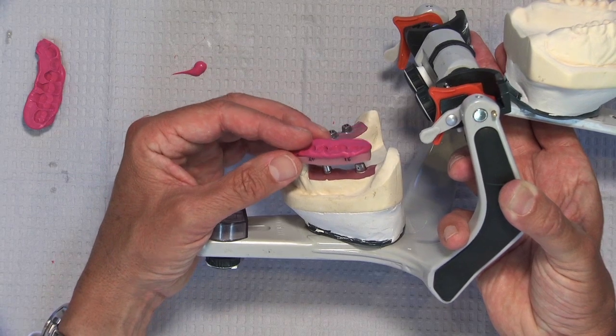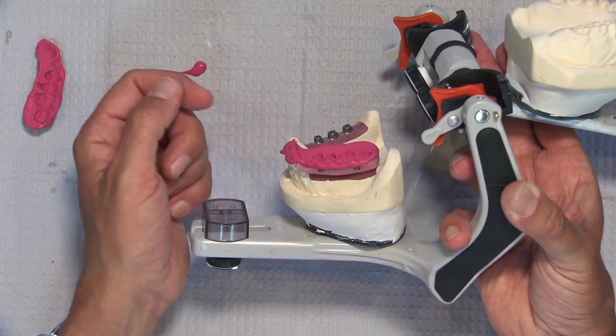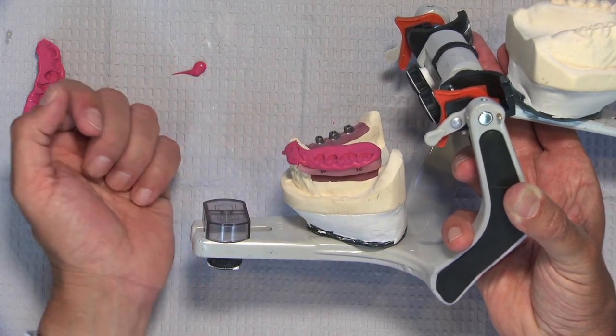So I'm a big fan of the custom abutments, and now that we're able to use this positioning bite index to be able to get a very accurate bite back to the laboratory, we can really minimize any adjustments we might have to make at the seat appointment.